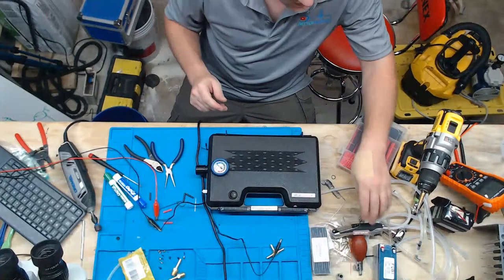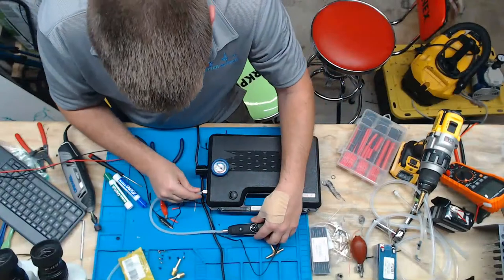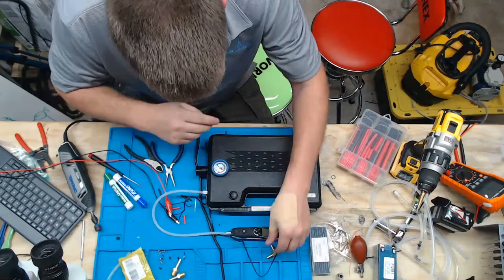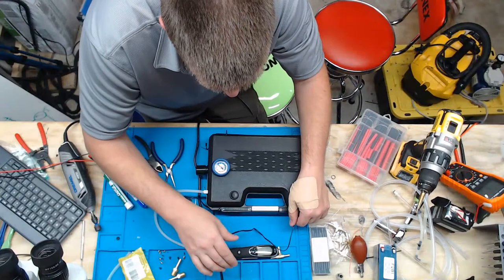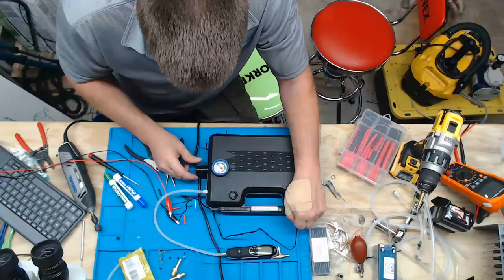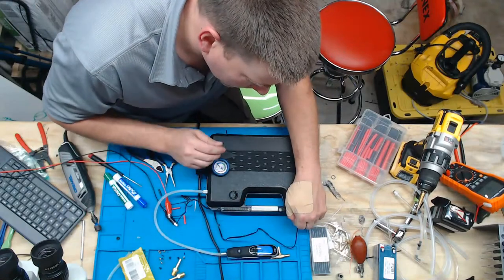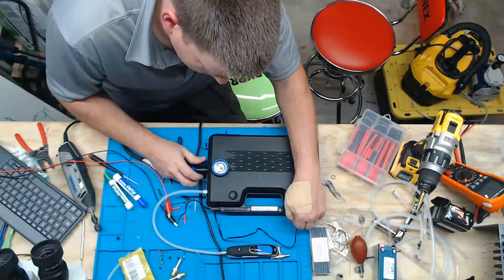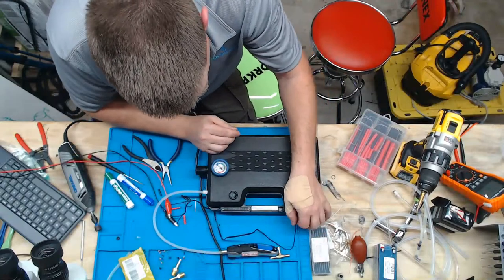22 PSI. So here's my digital gauge that I was telling you guys about. I will set this guy up here. You're going to see, I know, it's corny, but it's going to work. Trust me, it's going to work. Okay, set him up right there so y'all can see that it is working. Make sure this is all on. My bad.